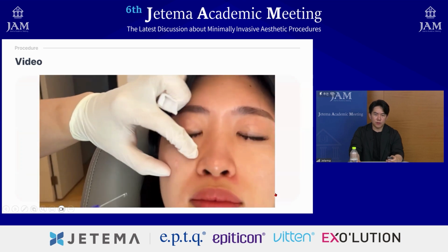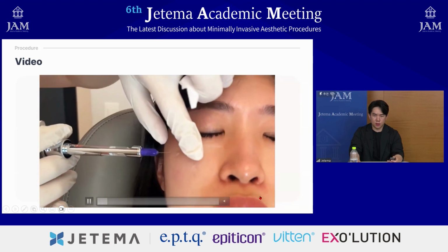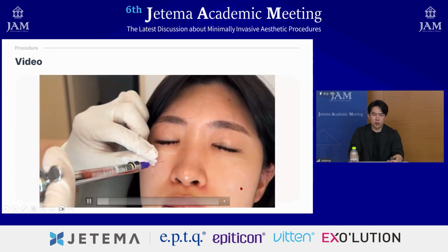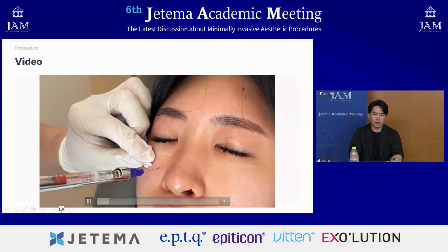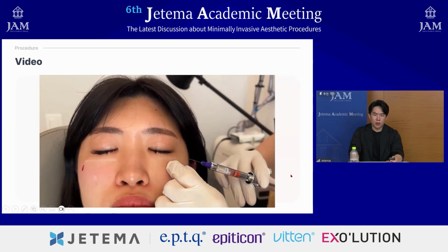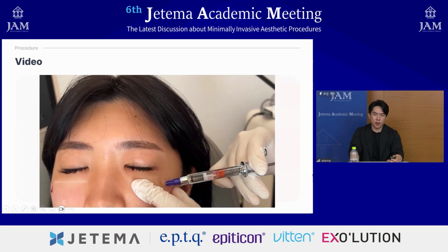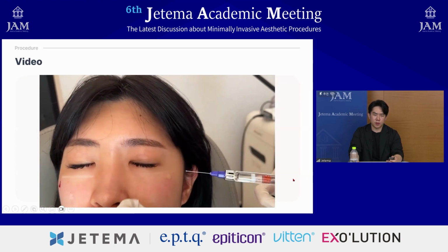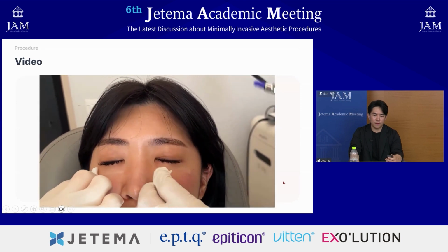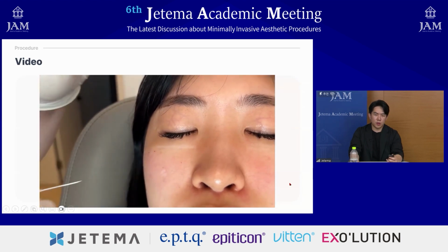Actually, this patient is very young, and I use dental lidocaine to decrease the pain and also to constrict the blood vessels that are near, to decrease the complication of the filler. I use both filler and thread, because for the volume of the front cheek, the filler will be the best option, and it'll also be very safe because there aren't that many vessels near where the filler goes. So first, I'll be placing the filler.